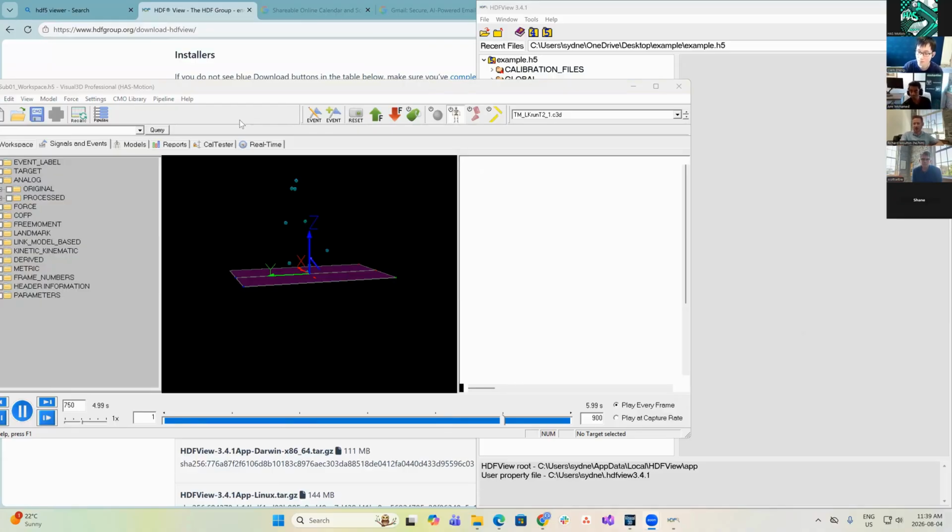So from Colin Bond, could Visual 3D call a .exe, PS1, etc., that imports the H5 file and outputs a report as part of a pipeline, in the same way that we can do with SIFT's command line interface via the .bat file? So I think, Colin, your answer there is that this kind of orchestration task is something that we believe fits better in SIFT's capabilities. And as you note, we can do this in the command line interface there. We're not looking to extend Visual 3D in that way.